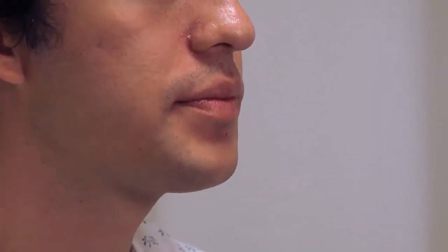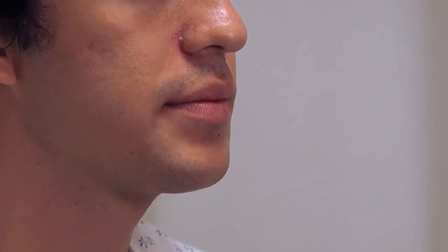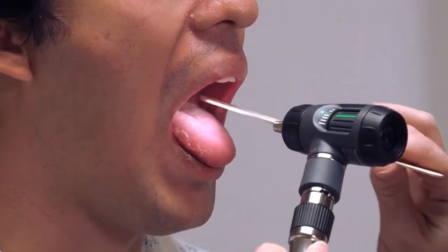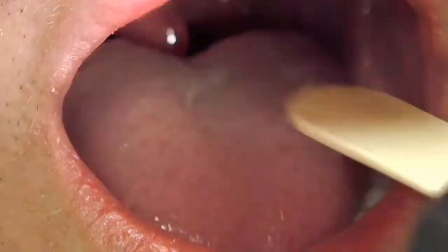To evaluate the posterior pharynx, ask the patient to open their mouth and see how much you can see. If the tongue is in the way, use the tongue blade to gently push it down — do your best not to gag the patient, though occasionally it's unavoidable. Ask the patient to say 'ah,' which raises the uvula, then gently press down on the tongue until you can see the posterior wall and the tonsillar area.